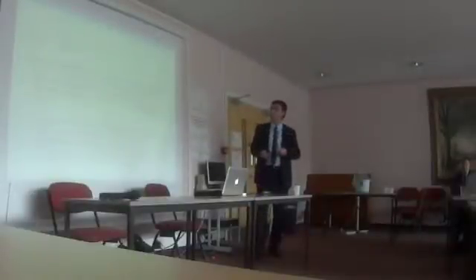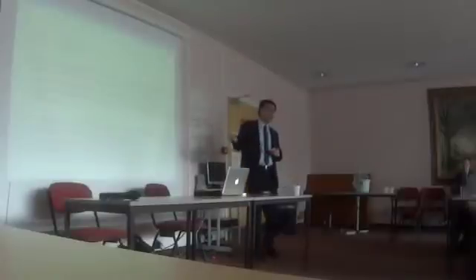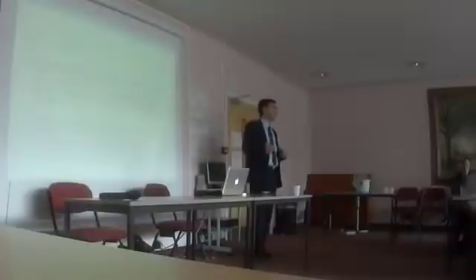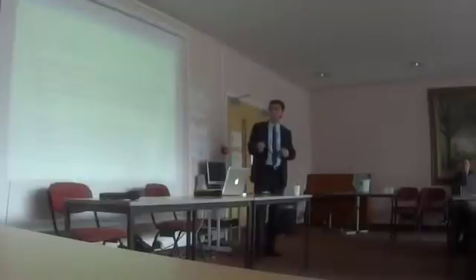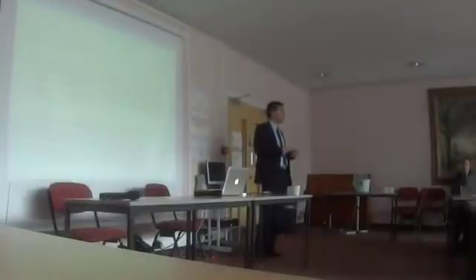For my patients, this is again a personal opinion, almost everyone who has got AF has to have an echocardiogram. And we have seen time after time patients who have no symptoms whatsoever, and the first time they come in with AF, they have heart failure. But there are certain subgroups of patients who may need a TOE for various reasons.